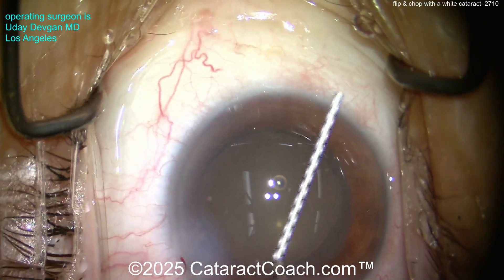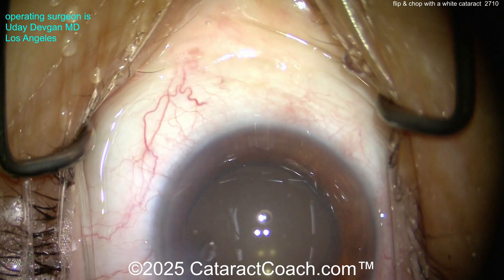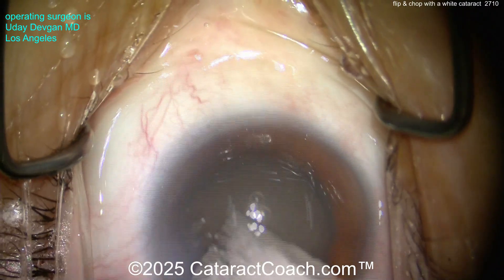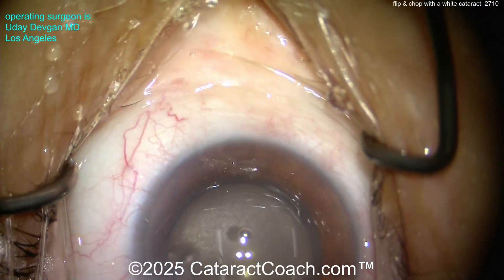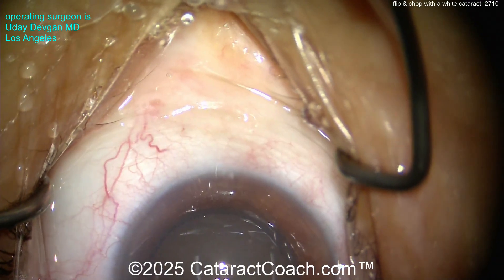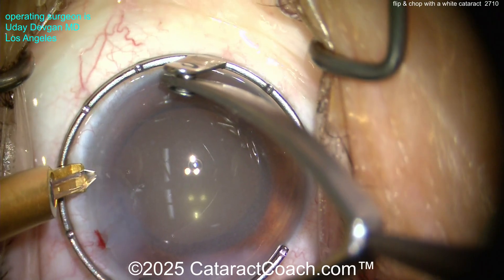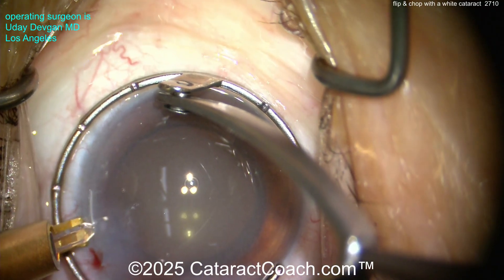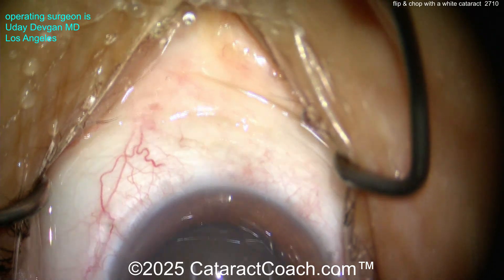Check the pressure — that looks pretty good; let's drop it a little bit. Now we'll do a little LRI. First, let's get tetracaine on a sponge to make sure the ocular surface is nice and numb — this patient is under topical anesthesia only, no block. Put the fixation ring down and do a little treatment for the astigmatism — maybe about half or even less. Looking good — fantastic case!